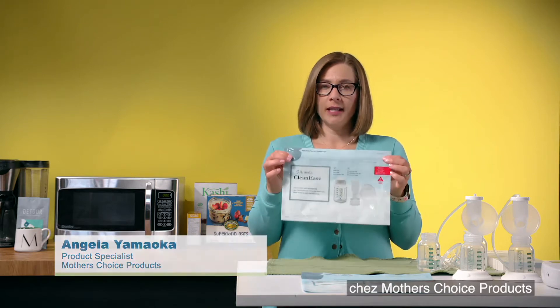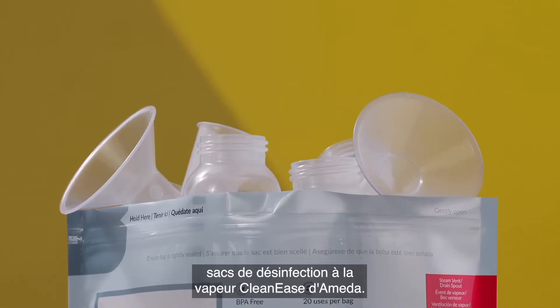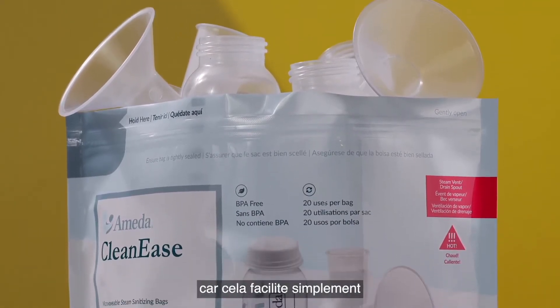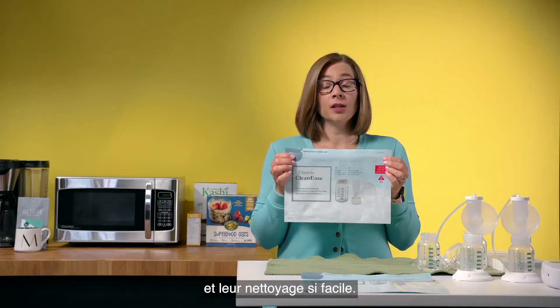Hi, I'm Angela. I'm a product specialist at Mother's Choice Products and today we're going to talk about the CleanEase Steam Sanitization Bags from Ameda. These are a great addition for any pumping mom because it just makes taking care of your pump parts and cleaning them so easy.